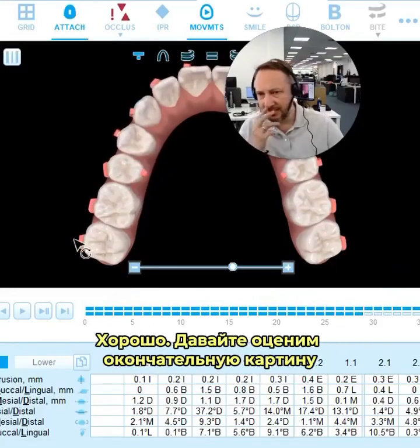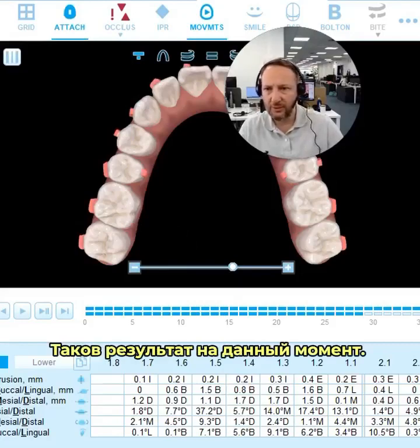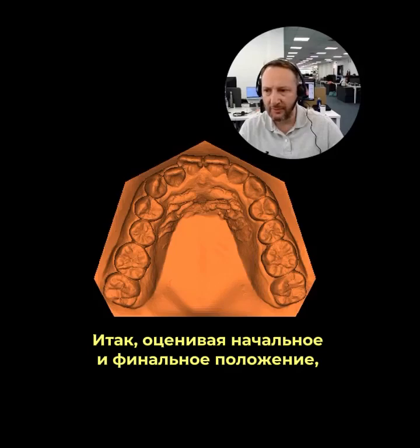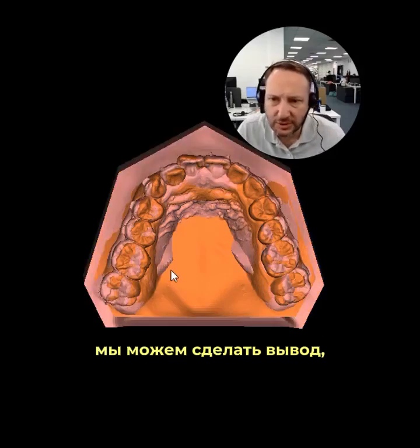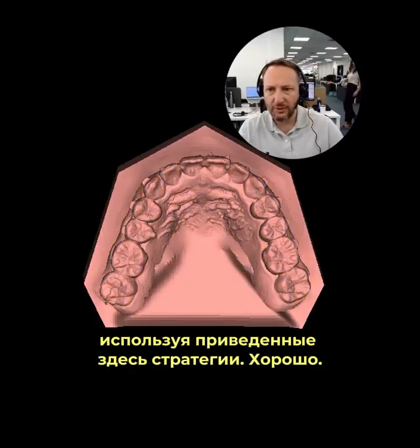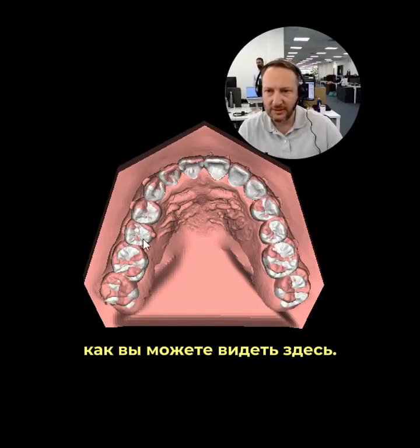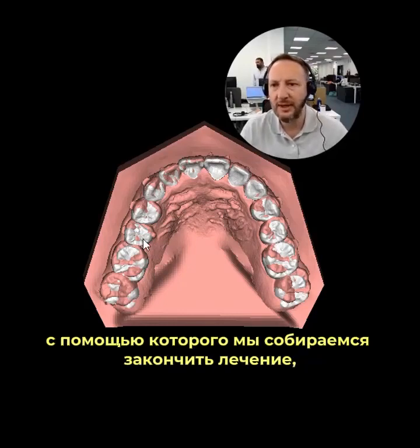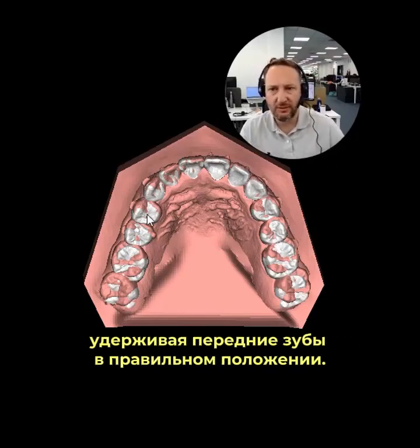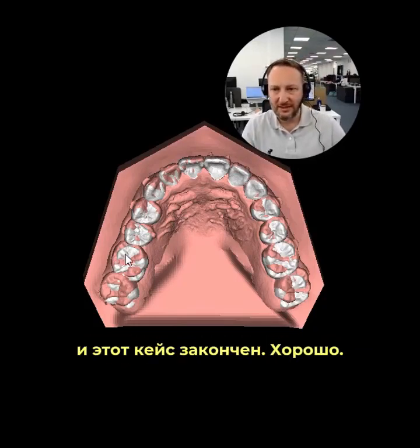After we finish this set of aligners and get to our quality control, where you can compare with the actual situation, this is the outcome so far. Bringing initial and final into this comparison, we achieved a good correction of the rotation using these strategies. Considering the ideal final position, we still need to distalize a little bit more, but now this is a much simpler movement, and we are going to finish this case with the anteriors already in a good position. This is just fine-tuning with another refinement, and this case is done.